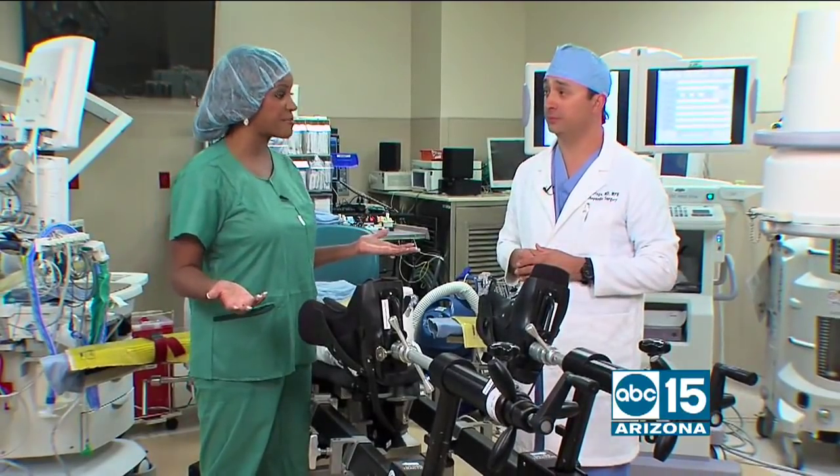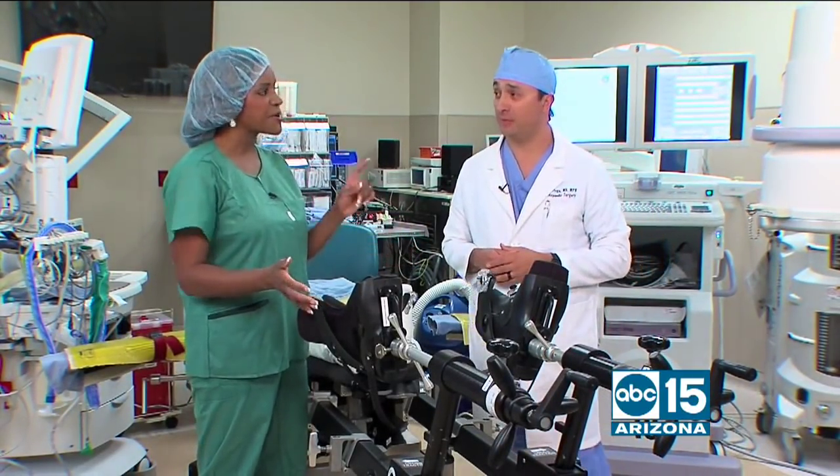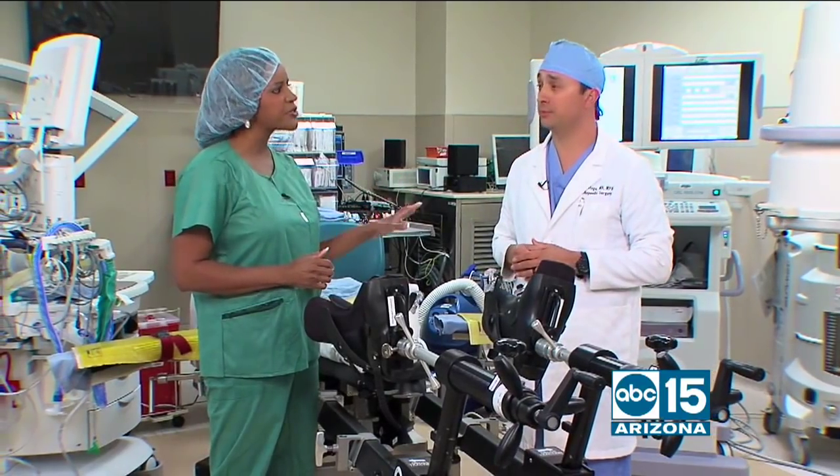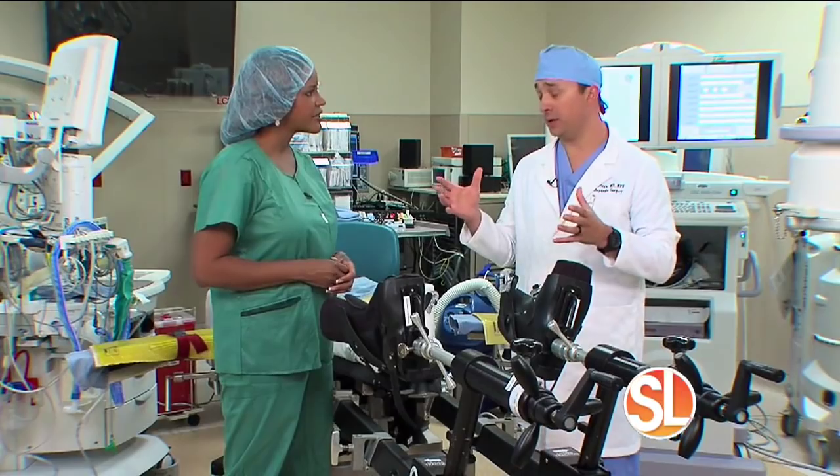We're inside an operating room and we're in front of a really cool piece of technology called the HANA table. We'll get to that in just a minute, but first I want to ask you: who's a good candidate for hip replacement surgery?